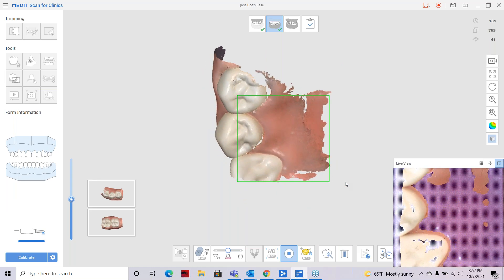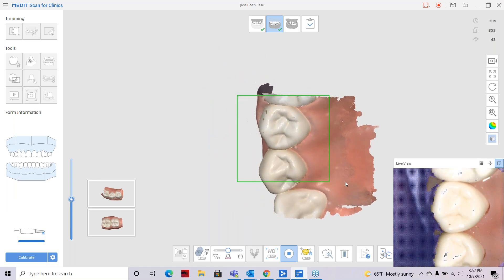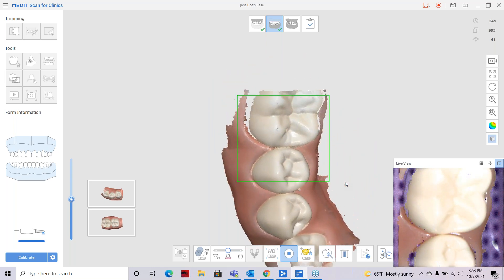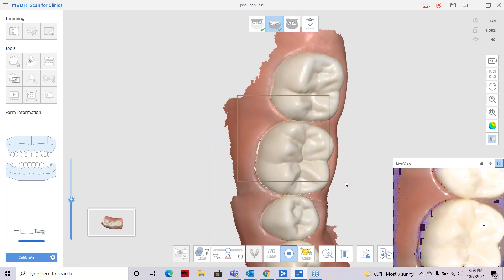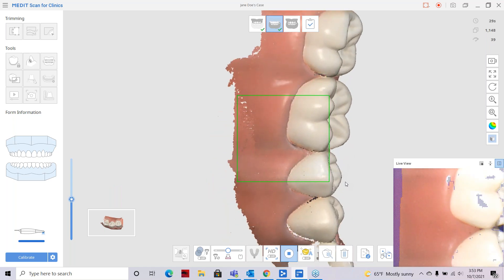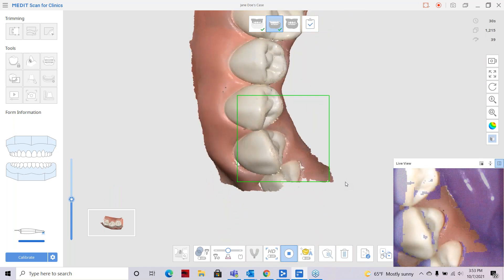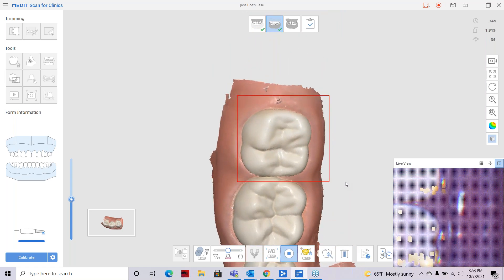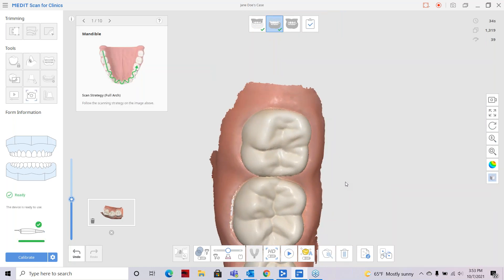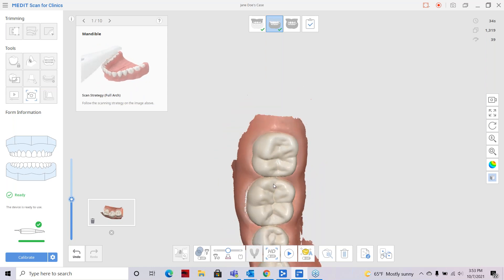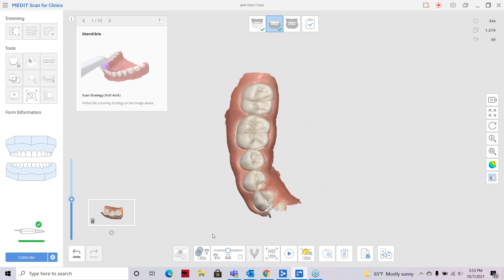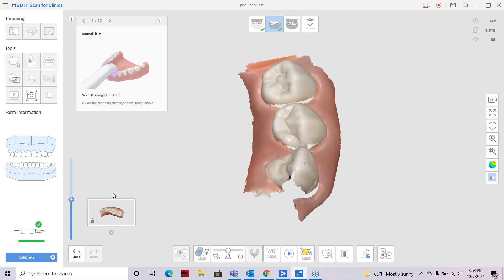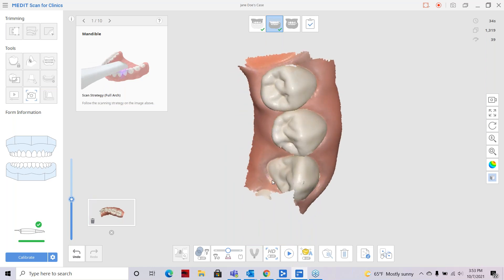You'll see thumbnails collected on the lower left-hand side of the screen. You can have up to five thumbnails. As I work my way back, you're going to see how a thumbnail disappears as it actually joins the scan data up. I can stop at any point in time and then switch out to another thumbnail on the side of the screen.